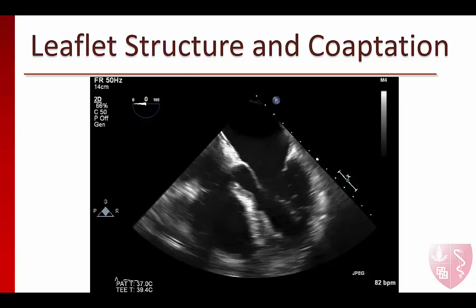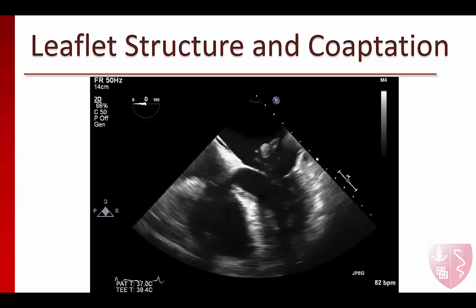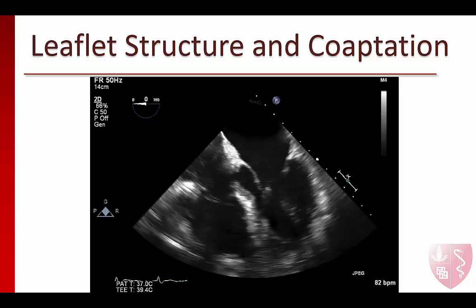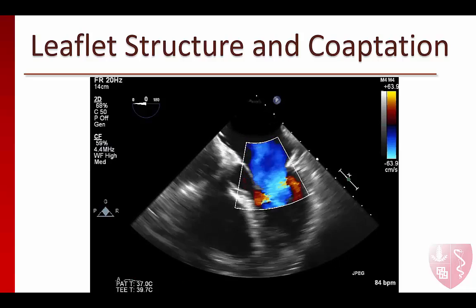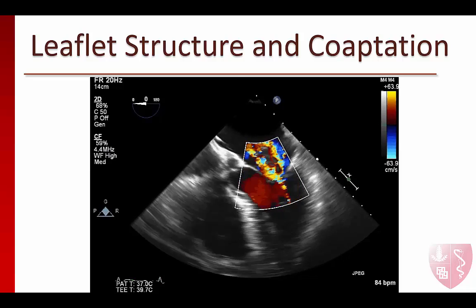Here we see the posterior medial papillary muscle flailing up into the left atrium. Once Colorflow Doppler is placed over the valve, we see evidence of severe MR caused by gross valvular incompetence.